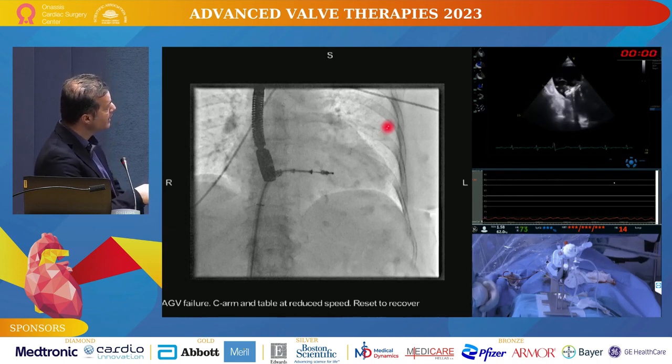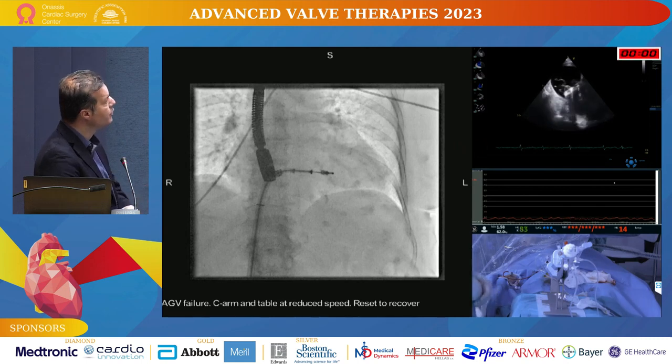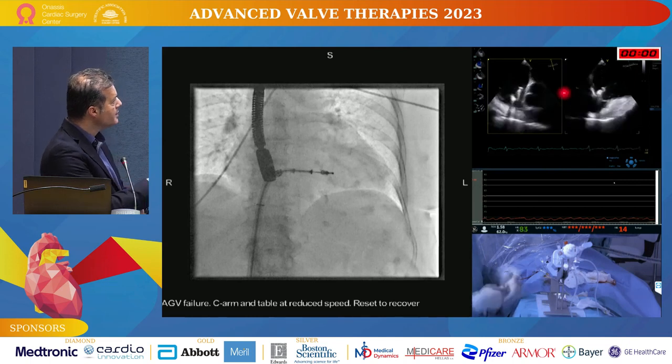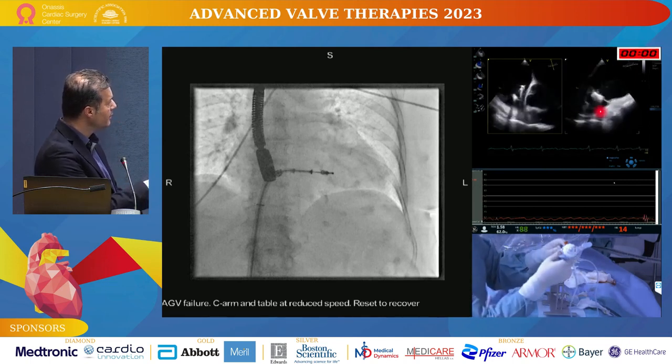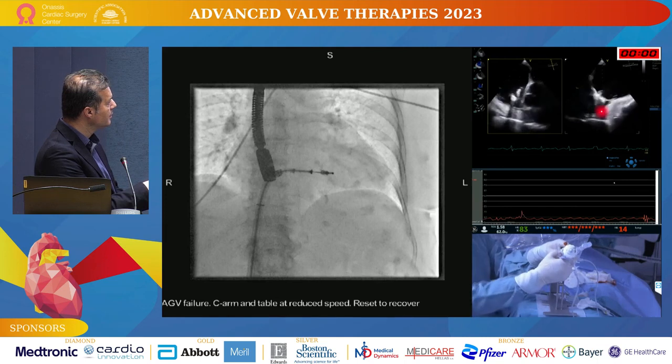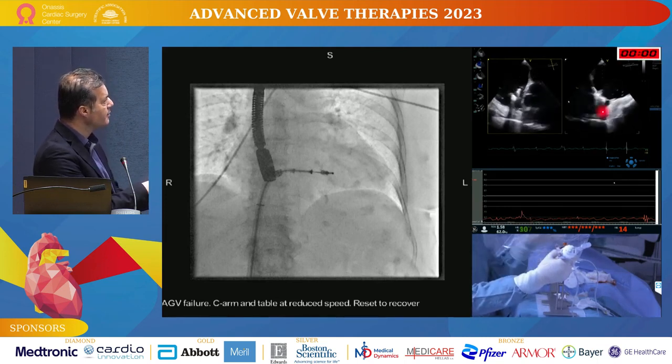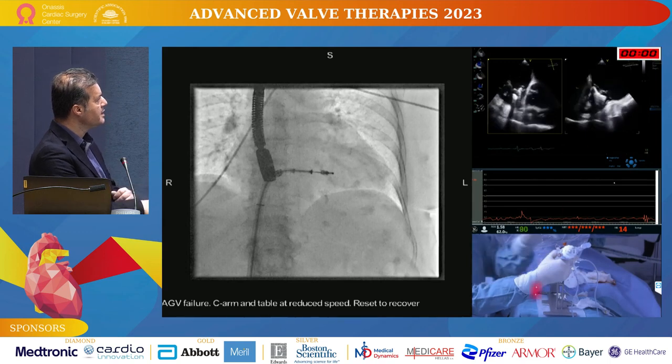We double check again on the transgastric view to make sure we haven't lost our location on moving in, and we haven't lost our perpendicularity. Now you can see the leaflets going in here on the right. We take our time. We want the leaflets to go flat on the arms, to be immobilized by the arms.